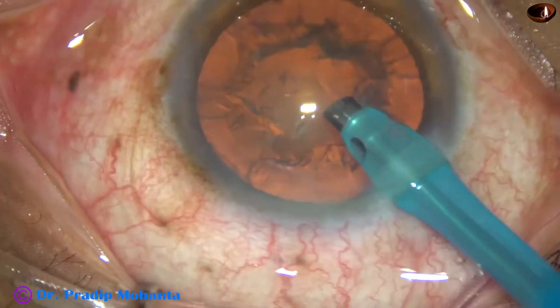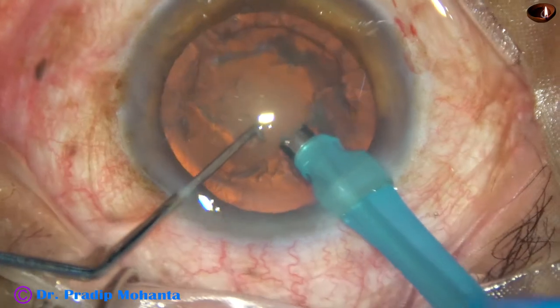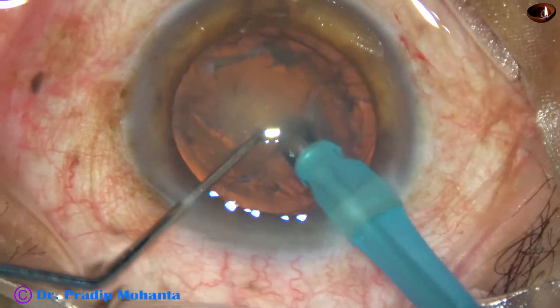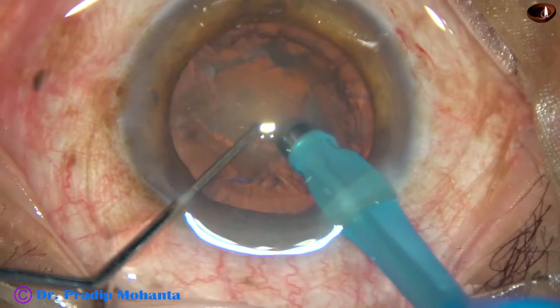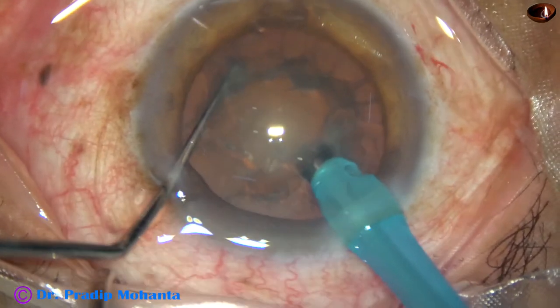The handpiece is turned and the bevel is up now. A small pit, a small crater, is made just in front of the main incision so that the tip can rest at a deeper plane.